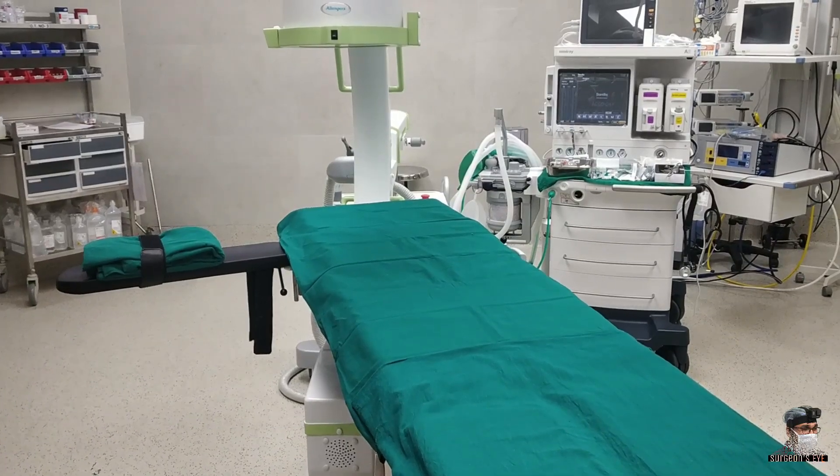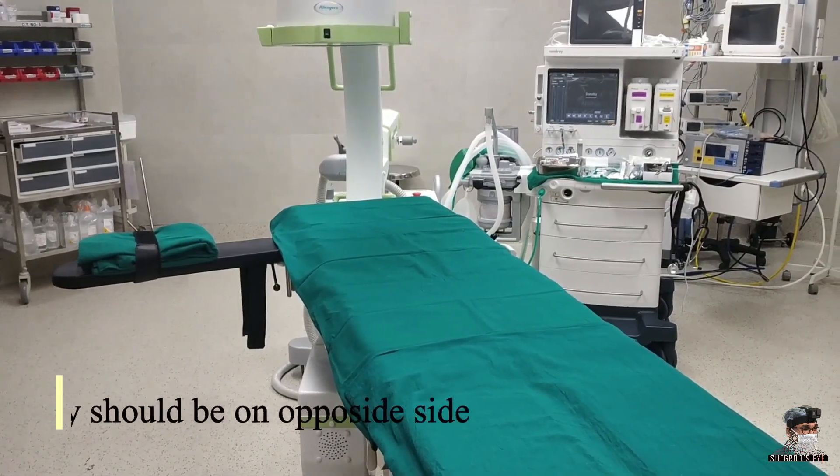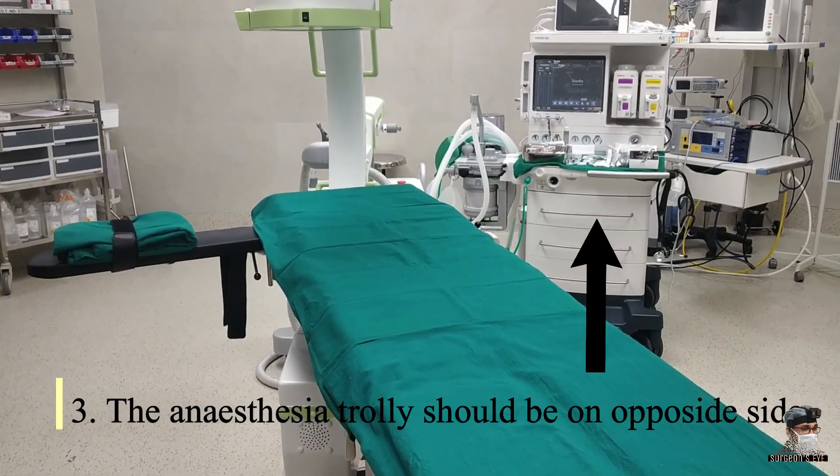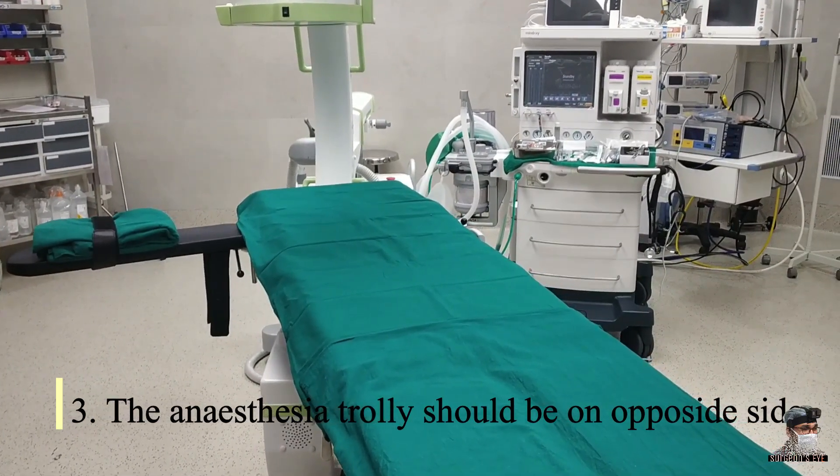The second thing is to have the C-arm from the head end of the patient. The third important thing is that the anesthesia trolley will be lying on the opposite side of the patient.